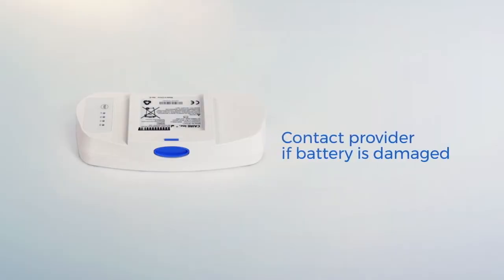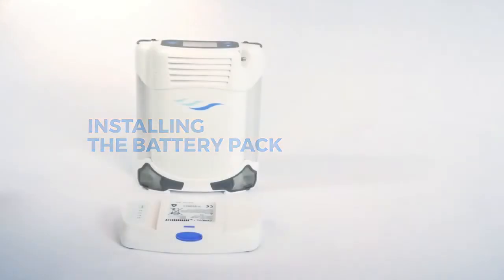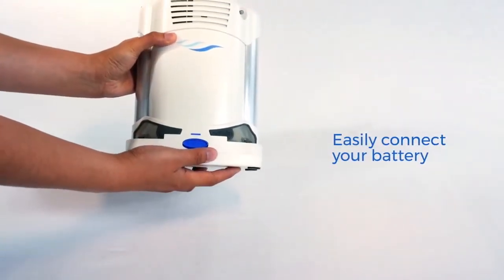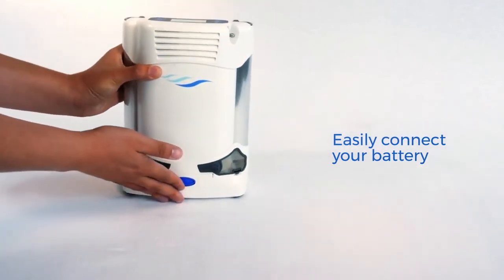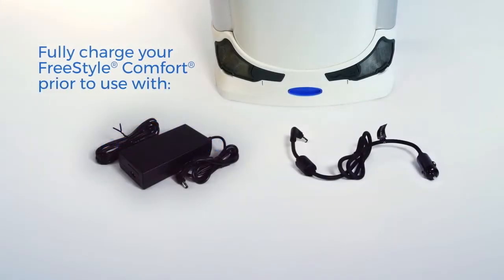If your battery appears damaged, contact your oxygen provider before use. To install, take the battery pack included with your device, align it with the tracks along the bottom of the unit and slide it back until you hear it click into place. You will want to make sure the battery pack is fully charged before you use your Freestyle Comfort for the first time.